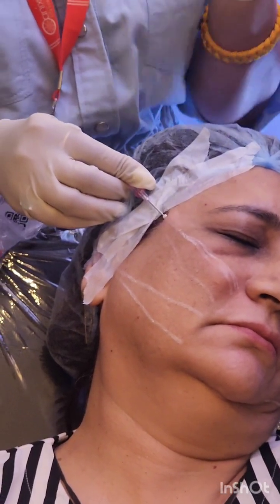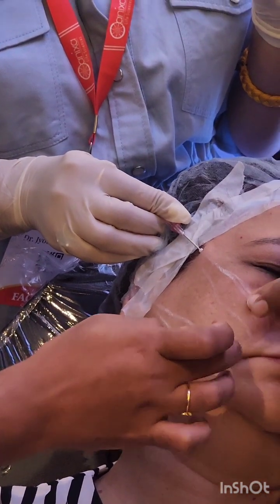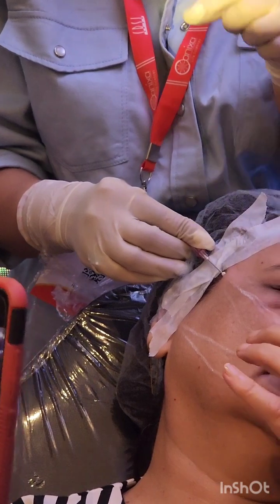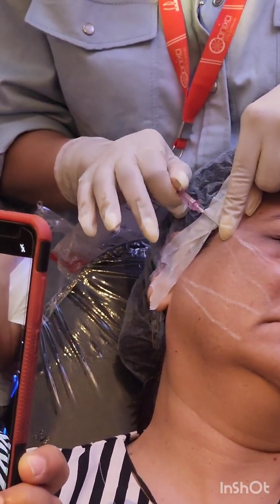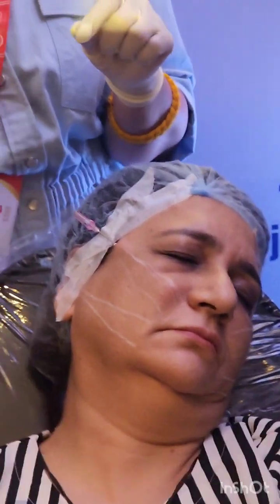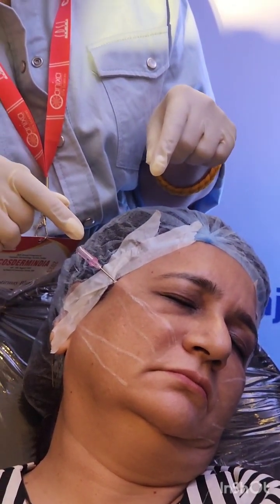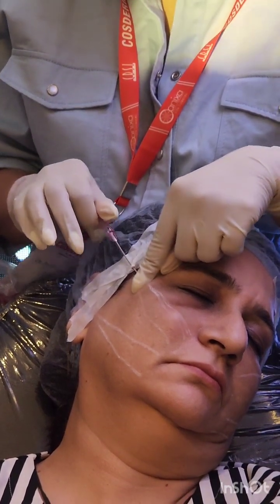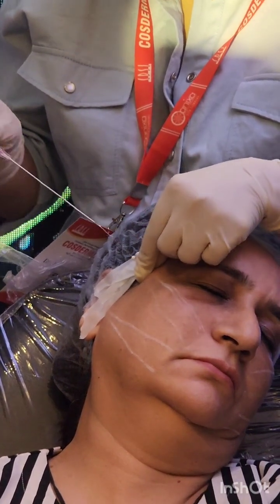No, you can feel. This is not a sterilized area. Yeah. You are in the right plane. Okay. Just 0.5 centimeter away from the line. Okay. Now give it one rotation that dislodges. Just one rotation; 2-3 rotations will trap the thread. It's the same system as PDO. Yeah. So one rotation and then I'll come out.